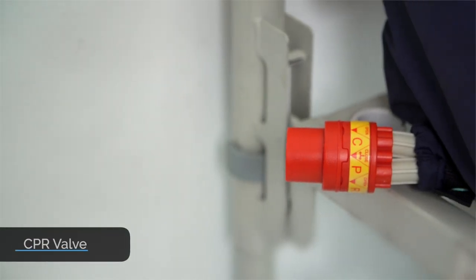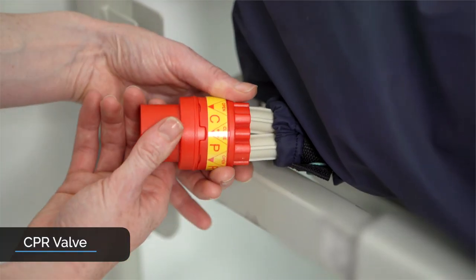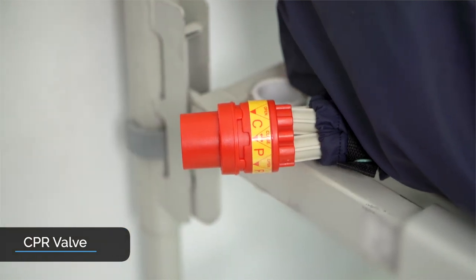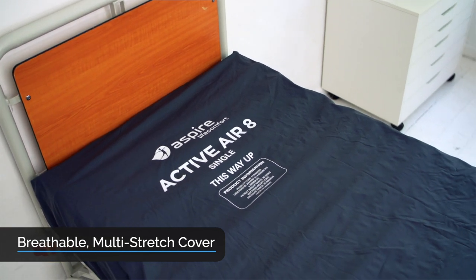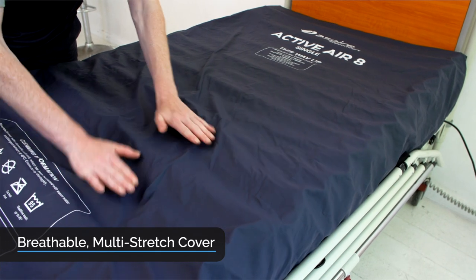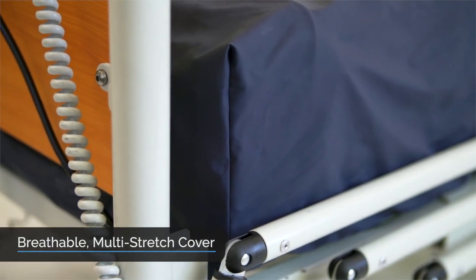The CPR valve is located at the head of the mattress in an easy to access location. When opened, it allows rapid deflation of the mattress to enable more effective chest compressions when resuscitation is required. Along with the alternating cells, the cover helps to reduce pressure injury risk — it is breathable to optimise skin microclimate, multi-stretch to reduce friction and shear, and seams are welded to prevent fluid ingress and infection control issues.